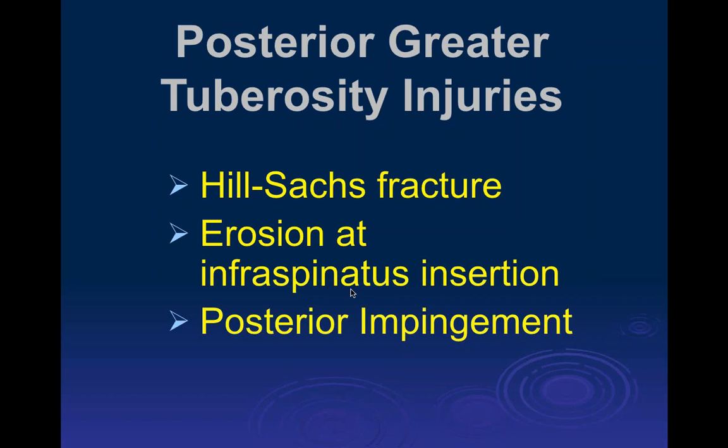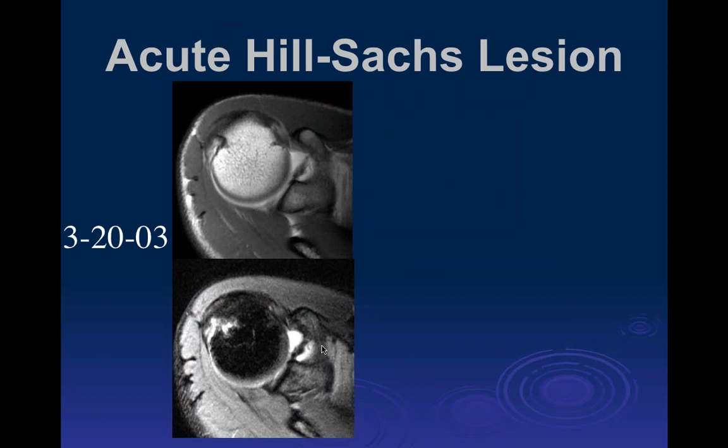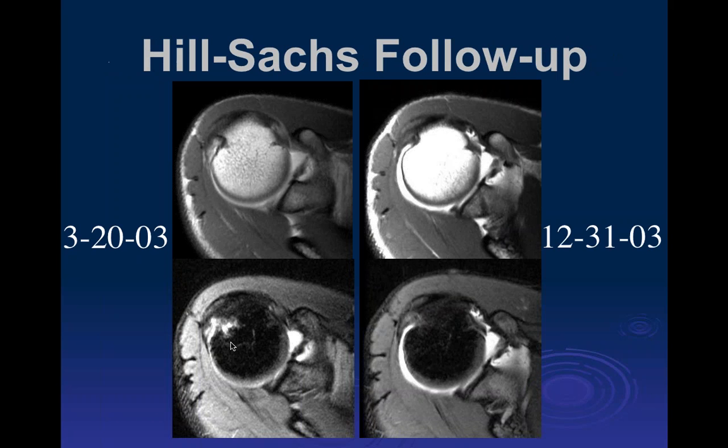So we've talked a lot about injuries to the posterior aspect of the greater tuberosity. We've seen it being a Hill-Sachs, erosions at the insertion of the infraspinatus, and posterior impingement as the typical findings there. This is the typical acute Hill-Sachs. We saw this case before. This is acute. This is later, after the bone is healed and you get rid of the bone marrow edema. So this is a chronic Hill-Sachs, which we commonly see, and this is more acutely right after it has occurred.